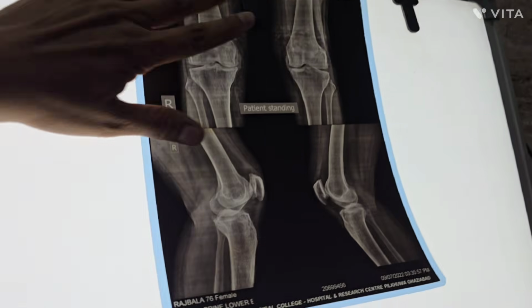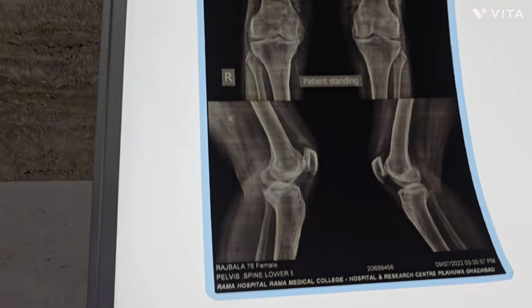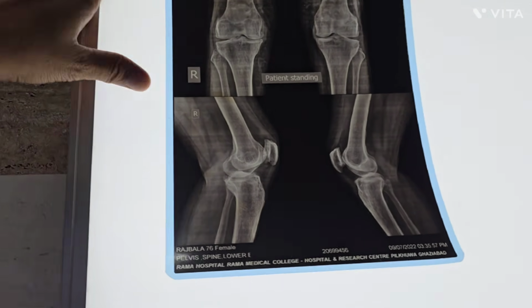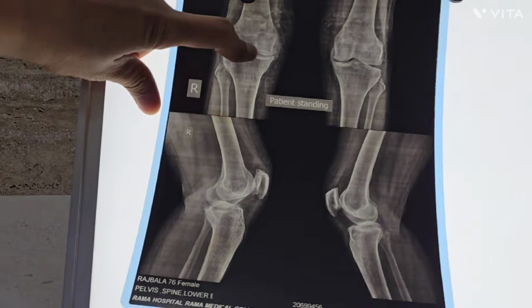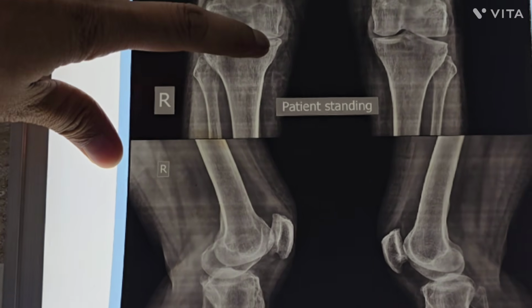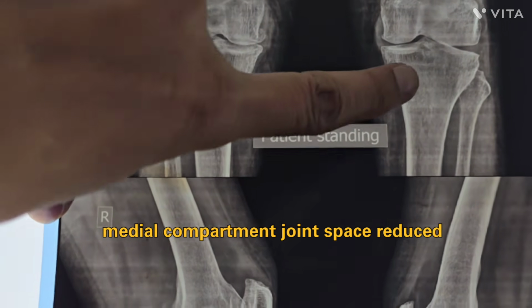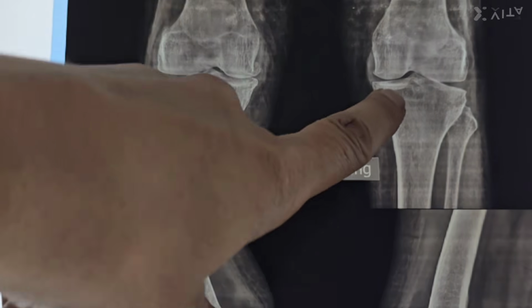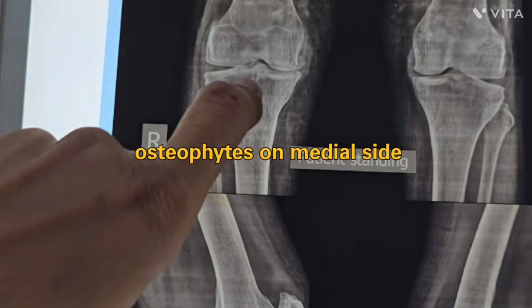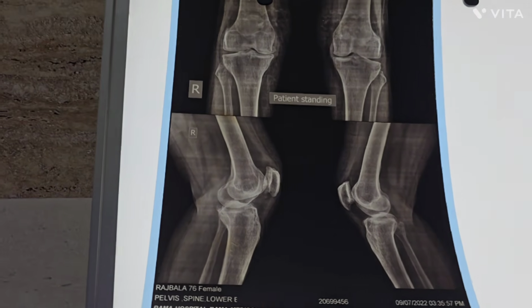Now the next patient is a knee patient. This is the X-ray of a skeletally mature patient's knee, AP and lateral view, on standing. In the standing view you can see the joint space. This is the lateral compartment, and this is the medial compartment, but in this case the medial compartment joint space is reduced. The normal joint space is almost 2 to 3 mm, but here it is reduced. These are small osteophytes. So this is a patient with osteoarthritis of the right knee.